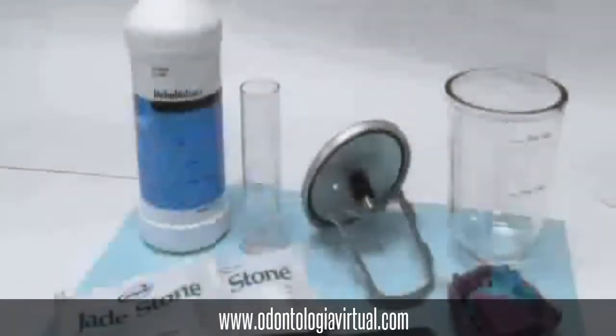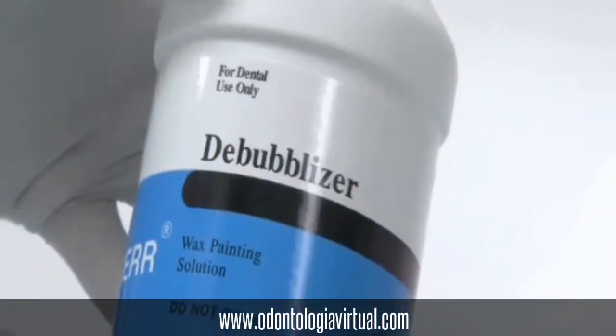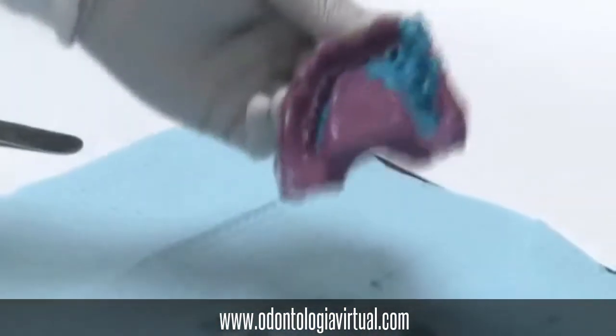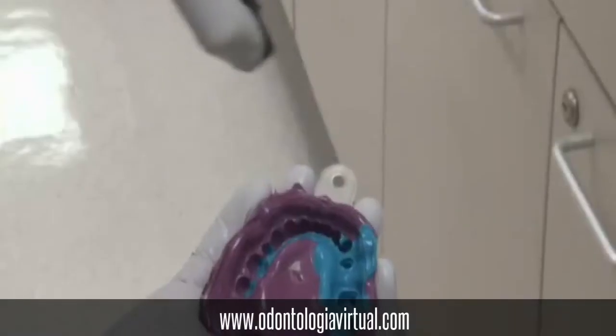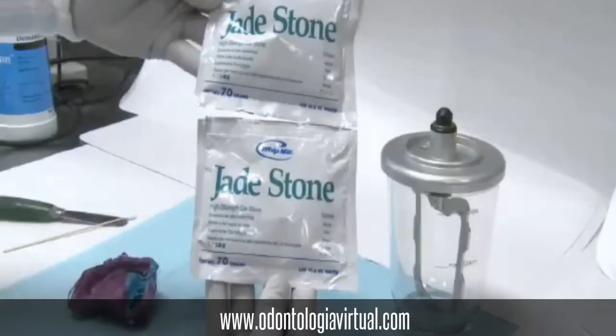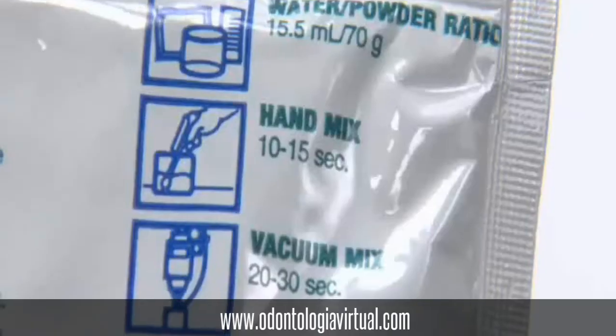We will be pouring up the impression. Once you have evaluated your impression, we will use the bubbleizer to break the surface tension of the impression material. Make sure you remove the excess. You can also use a syringe or some air to blow off the excess.